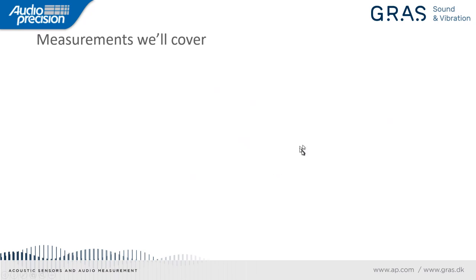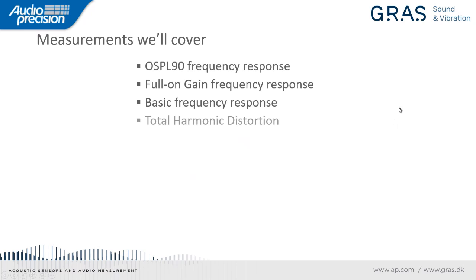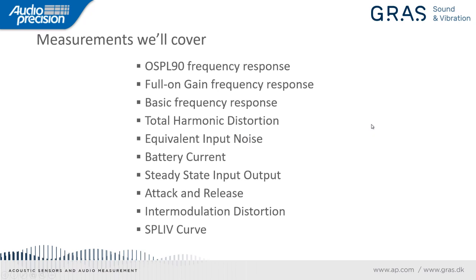Now, some of the measurements we're going to cover today, I'll go through these in detail in the subsequent slides, but I'm just going to mention them for now. So we have the OSPL 90 frequency response, the full-on gain frequency response, the basic frequency response, total harmonic distortion, equivalent input noise, the battery current, the steady-state input-output, attack and release, intermodulation distortion, and the SPL-IV curve. And as I mentioned, I'll explain all of these in subsequent slides.